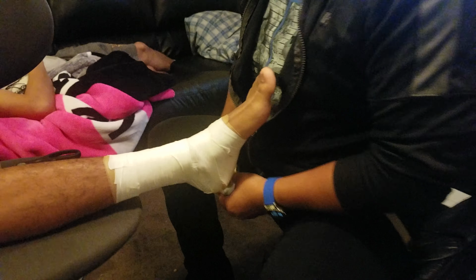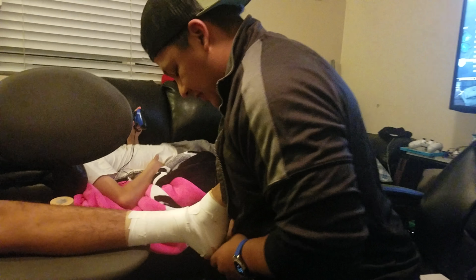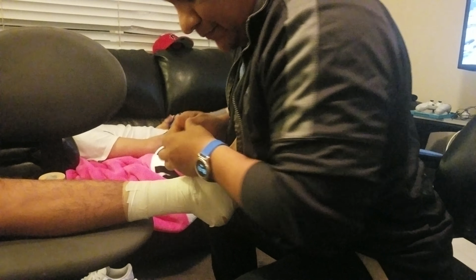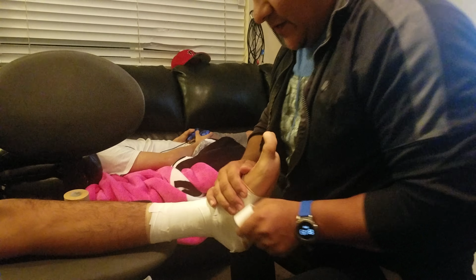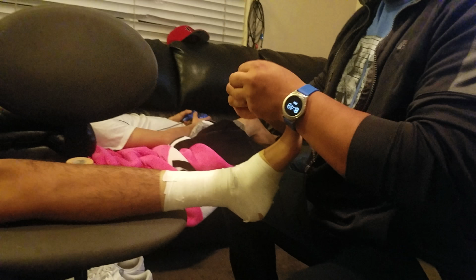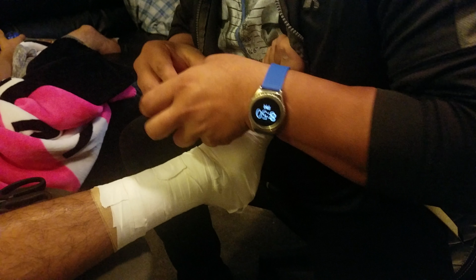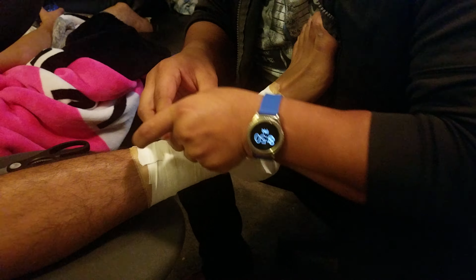So once we're done with there, do the same concept right under here, because we can still continue with the basket weave process. This is just to keep it stable and locked for the middle of the arch. But we can go ahead and do one more figure eight to keep it all locked in. So from there, around the heel, around the ankle, up and over and under.